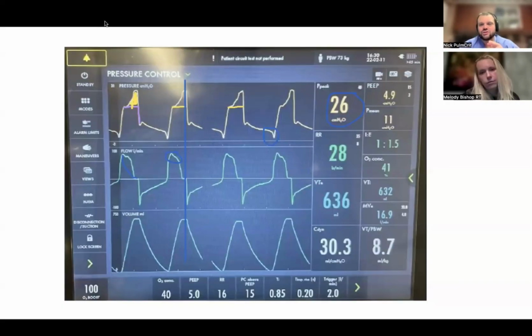It's like, as you said before, the patient is a constantly moving target, and then the vent's also a constantly moving target. So you're trying to balance two things that are doing their own thing, to have them work in unison. But as the patient does more, the ventilator then does more to try to compensate for what it thinks it should do. So in my mind, as I've said ad nauseum by now, I think it's the worst mode, because you're giving the ventilator the freedom to do what it thinks it should do. And most of the time, when you need it to do the least, meaning get out of the way the most, it's when the patient's the sickest, and then it just does whatever it wants, and things just get off the rails.